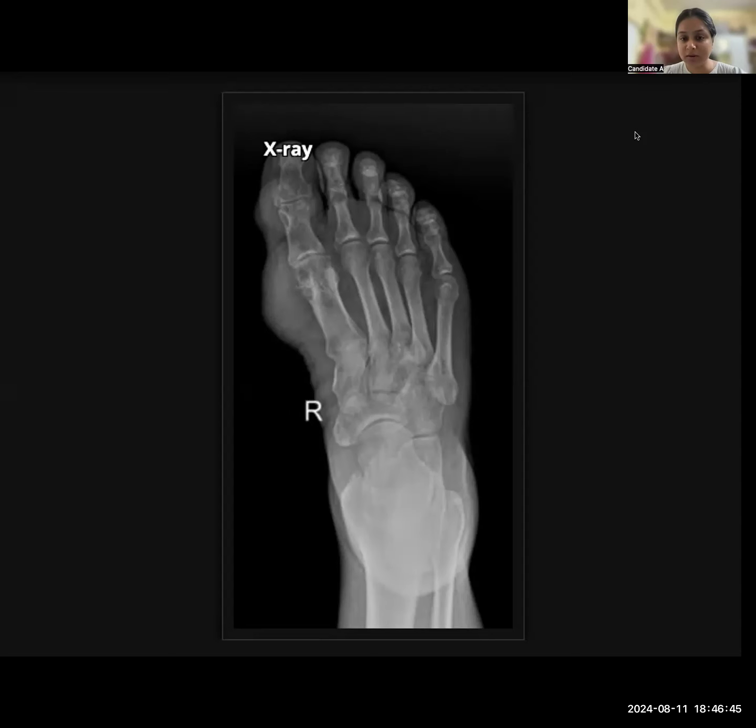Yeah, could I just ask two doubts? Sure. In the barium swallow case, we said that it could be migration. So what would be the normal region that this stent would be in?